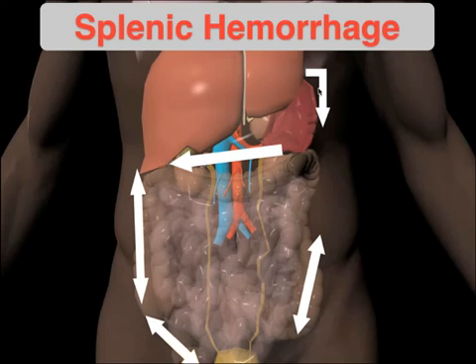But if you look here, the vast majority of fluid initially is going to get pulled into the subdiaphragmatic space. And that's because as the patient takes in a deep breath, you're going to decrease intrathoracic pressure but increase intra-abdominal pressure, and vice versa will happen when you exhale. So it's almost like a toilet plunger effect. Fluid is going to get pulled into that subphrenic space.